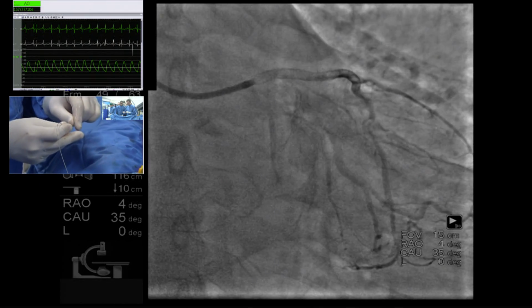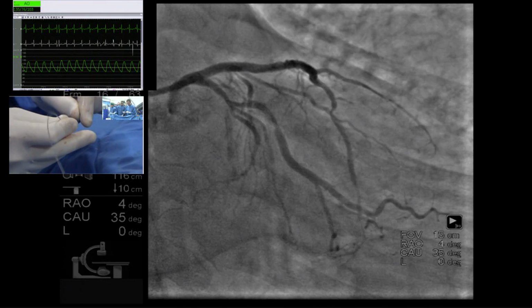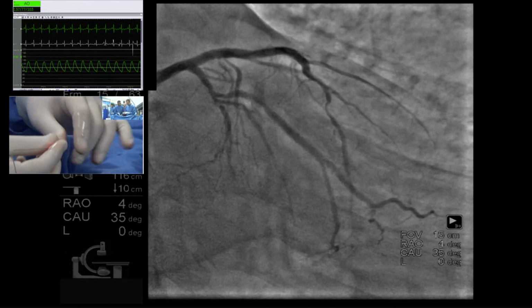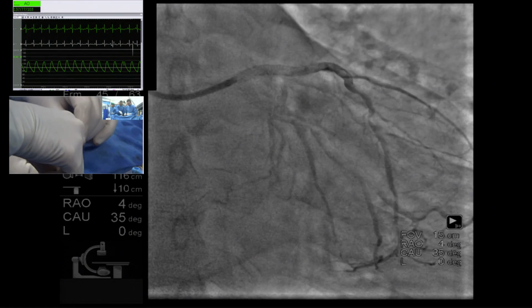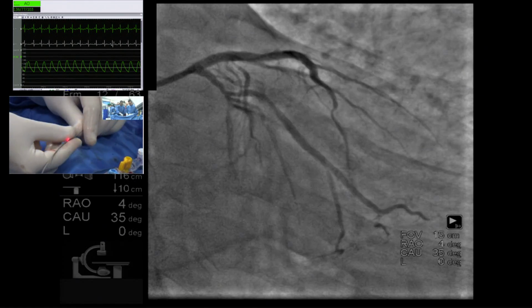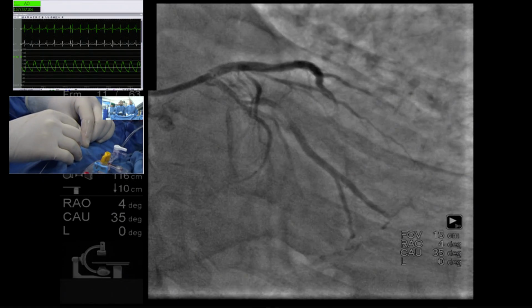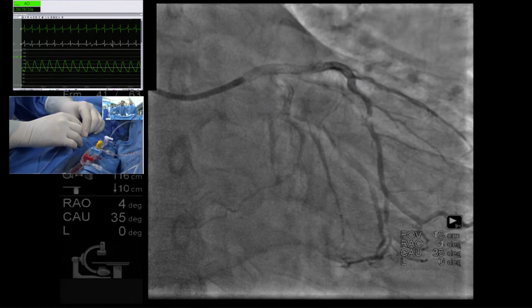Mauricio, I will answer, but I'll answer knowing that you always do the opposite of what I suggest. Well, that's my personality. I'm a contrarian by nature. I would say I will use a non-compliant balloon to see what the lesion is like and image after that.